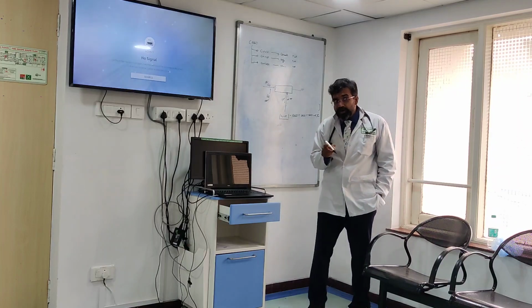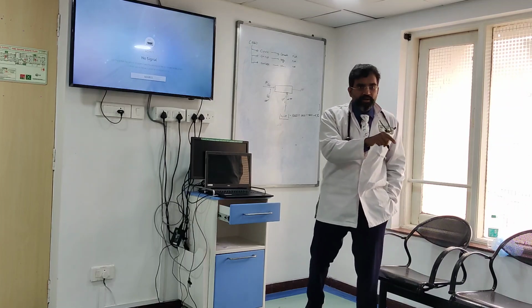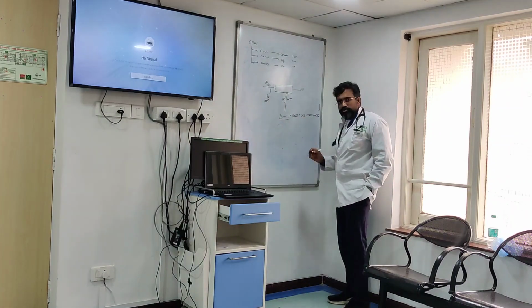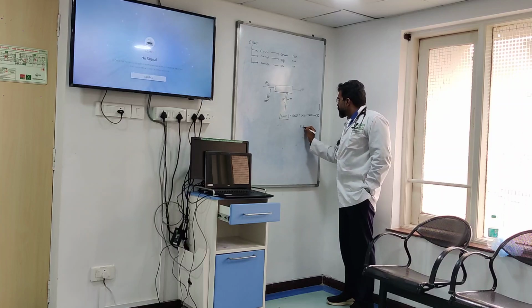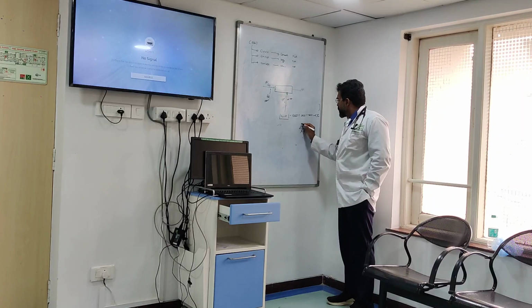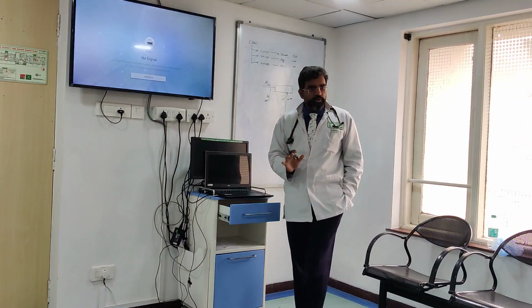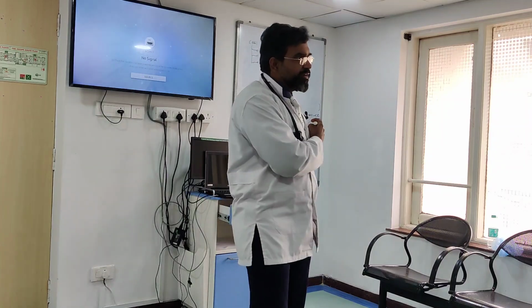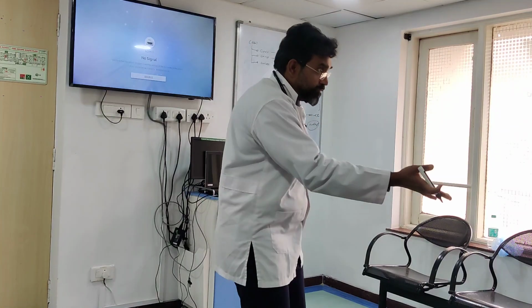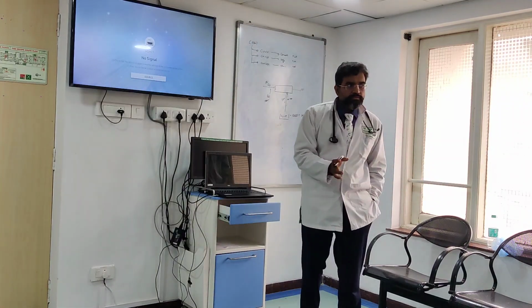Yes, I want to make it ml per hour. And what is my dose in? Per kg per hour. So now let me make this a 70 kilo individual. 1200 ml divided by 70. 7 ones are 7, 7 twos are 14, so this is 17 ml per kilogram per hour. This is my dose. You got my dose now? Is this dose adequate? 25 to 35. Exactly. Okay. Understood this? Clear?